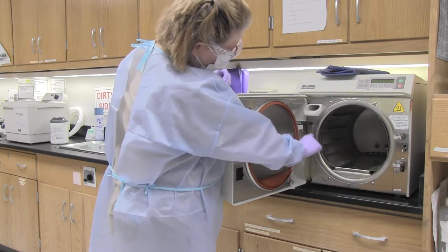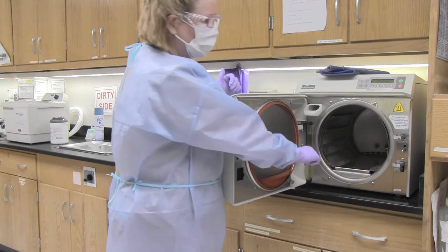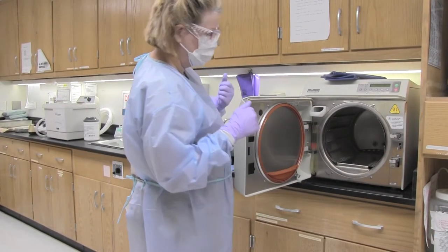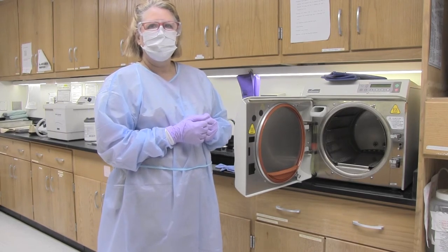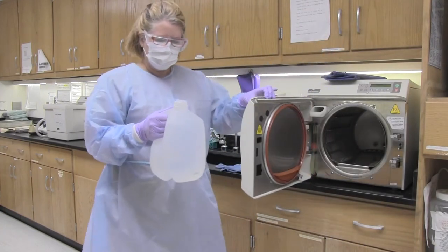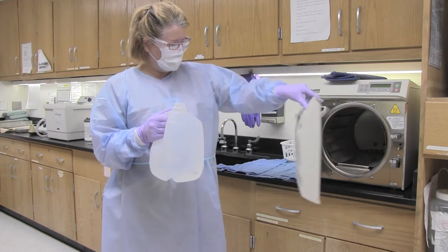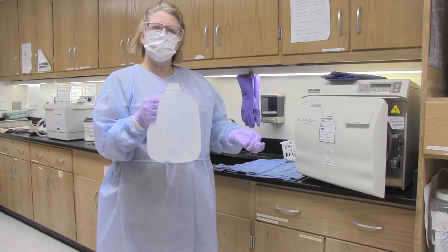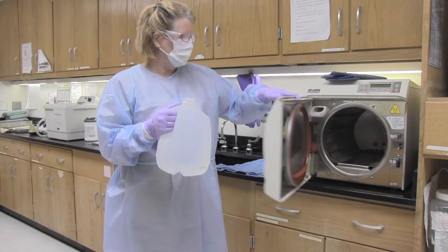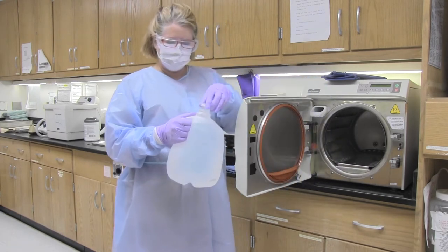If the water level gets down to red, there is not enough water in the autoclave to run a cycle properly. Make sure the water level is in the green zone, about halfway up — this actually looks pretty good, so we don't need to add any water today. Please make sure the ring from the water jug is removed before pouring when water is needed. There is a little ring you want to pull off and discard. We have had students in the past accidentally pour the ring into the unit, so make sure you are not that student.